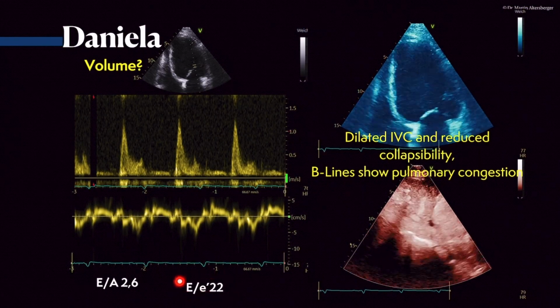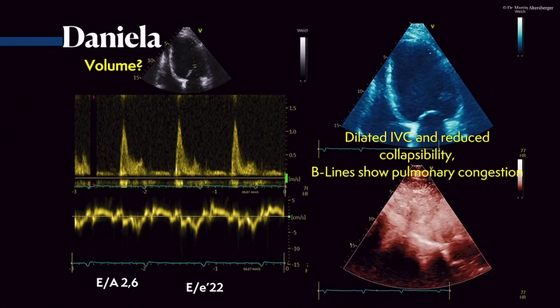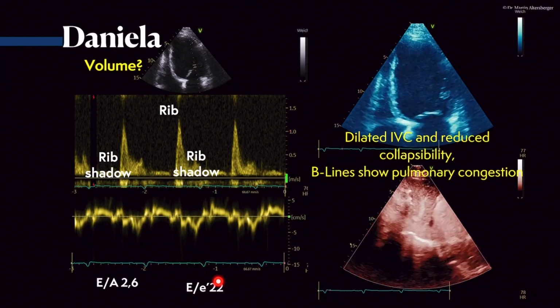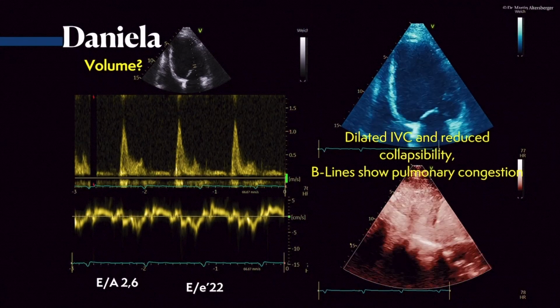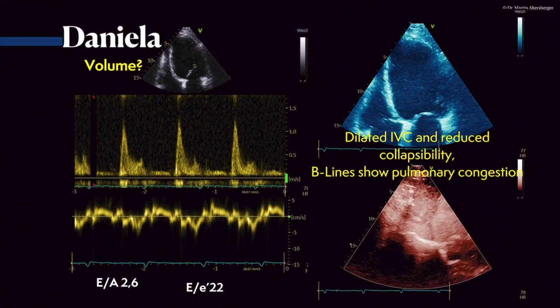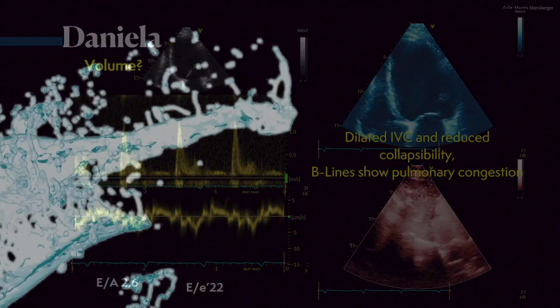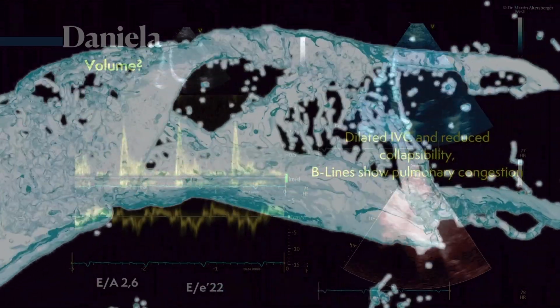Before the acute decompensation, it was in the range of 15, mean measurements, so medial and lateral. In this decompensated state, it was elevated to 22. So we have many indicators that there truly is hypervolemia present. And of course, this patient therefore is congested and needs diuretic therapy.